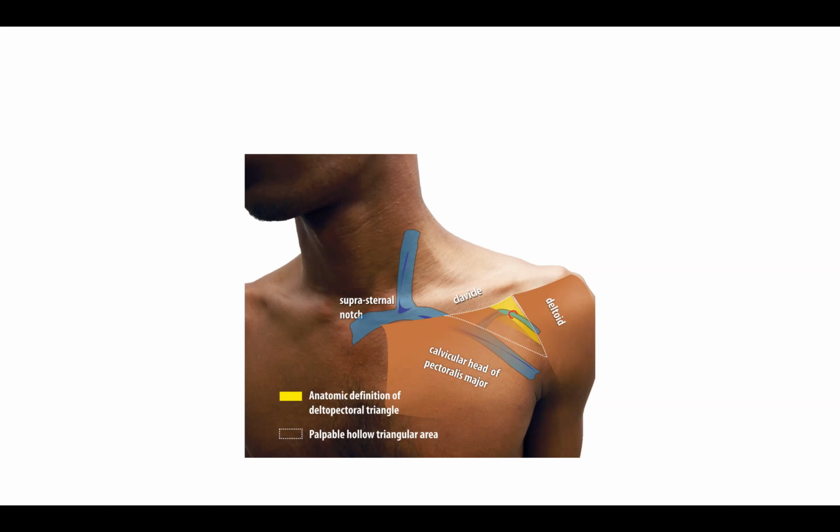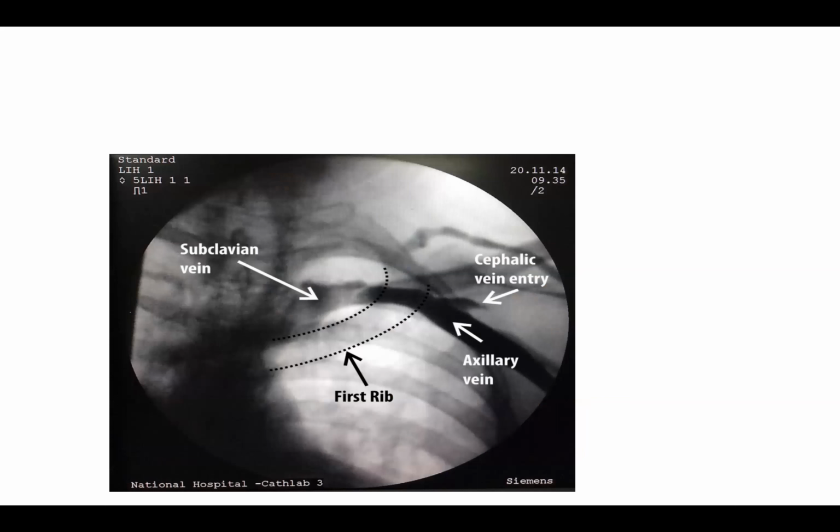There are some patients that don't have enough fat, so you don't have that very deep depth, while some have so much fat and they have a lot of depth. So whatever you are dealing with, ensure that the needle goes horizontal to hit the clavicle, then navigate it when you are taking the access from the pocket. Those are the key things, and still follow the same landmark as we described. Those are the key things that we must note.